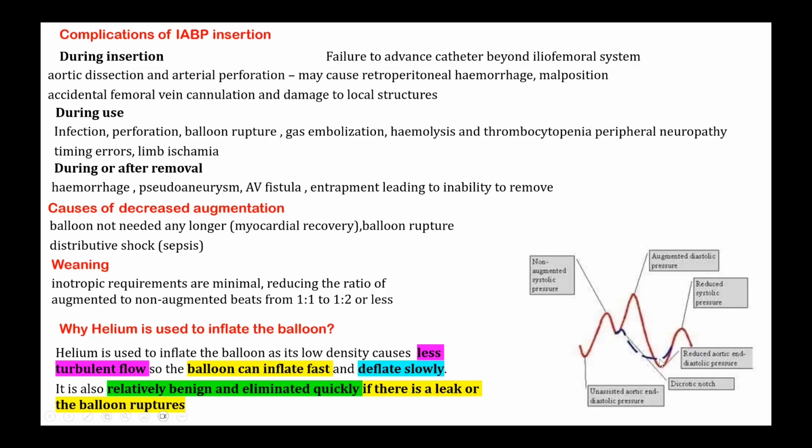So this is the change that is happening compared to the normal. This blue line indicates how the normal arterial waveform should be. Instead of that, at the dicrotic notch level itself, the diastolic downward slope is pushed up. So this is what is happening. And if you get a waveform like this, then only it is indicative of the normal pattern of the device working. Okay. So this is a slide I prepared long back.